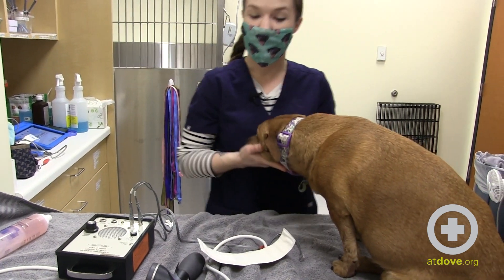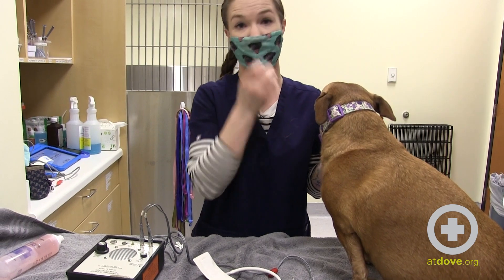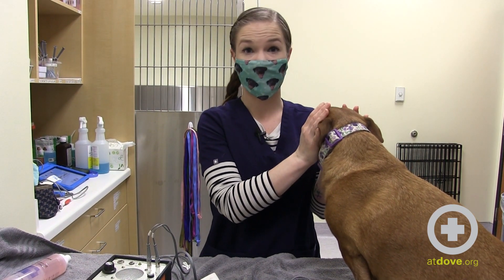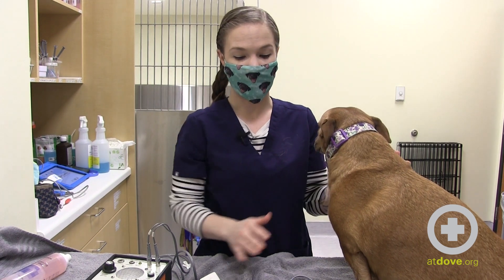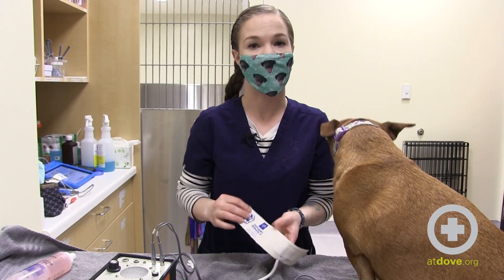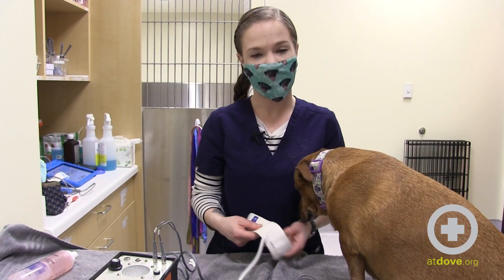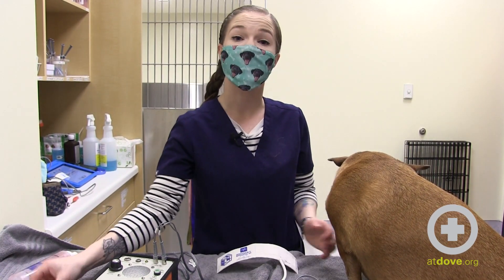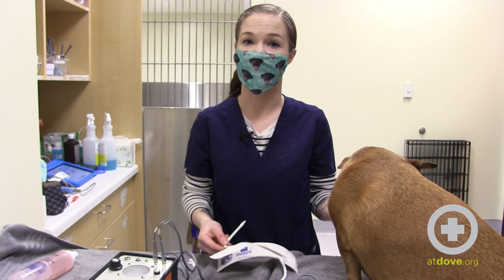Some other common issues are blood pressures that are really, really high or really, really low. Now that may be a true diagnostic number, but it can also be very much affected by the techniques we're using. If your blood pressure seems very abnormal, you can troubleshoot some of the things you're doing. The first one is cuff size. If your cuff is too large for the animal, you'll get a blood pressure that's too low. But if it's too small, you'll actually get a falsely elevated blood pressure.